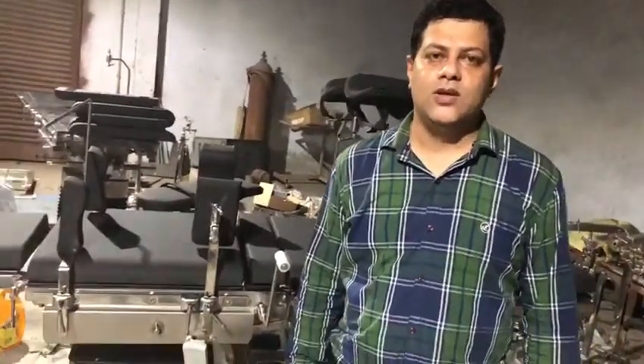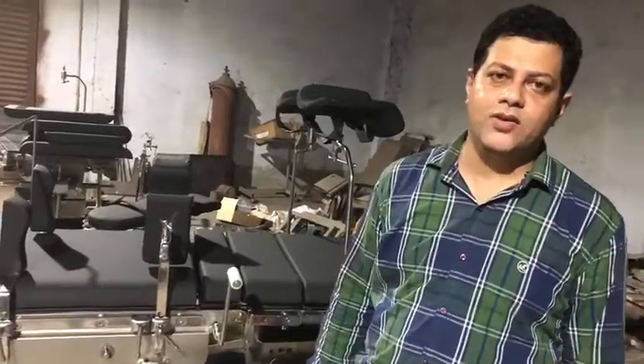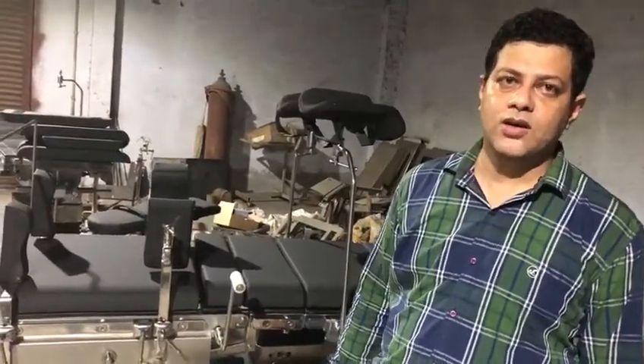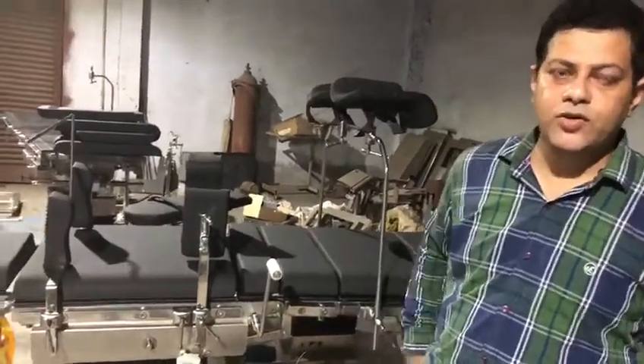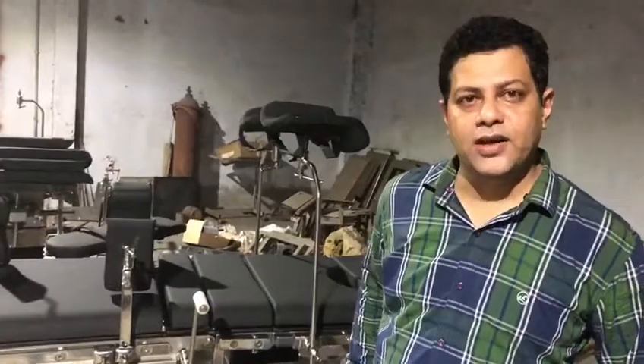Hello everyone, good evening. This is Tarun Mehta once again for you and I would like to introduce our product which is DG300, and it has a provision of two electrical and one manual, which is an OT table. I will walk you through all the positions and the functionalities.